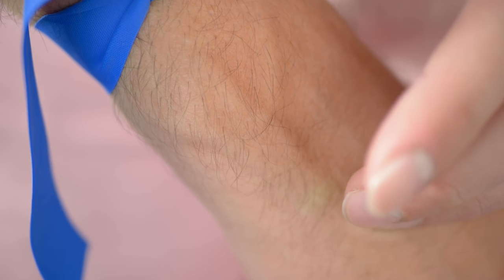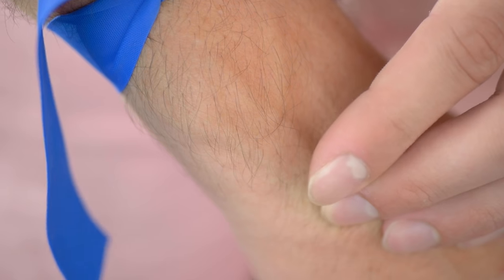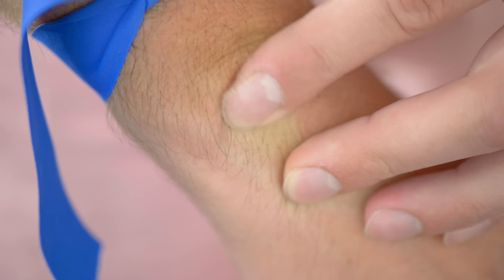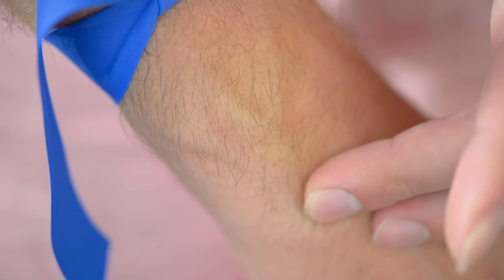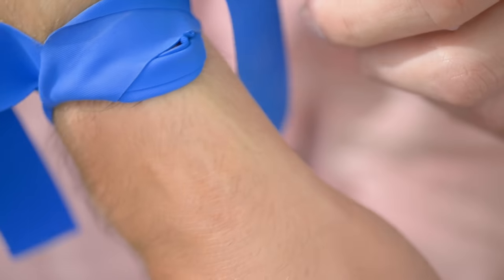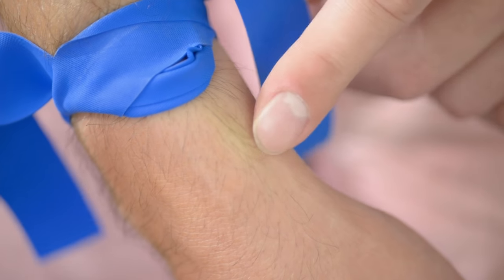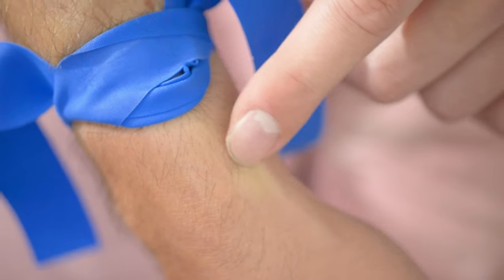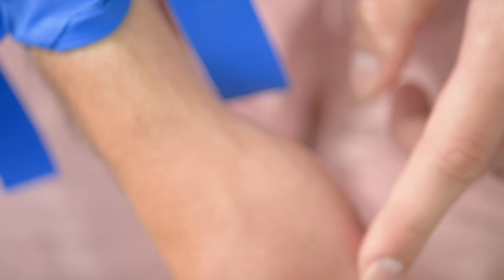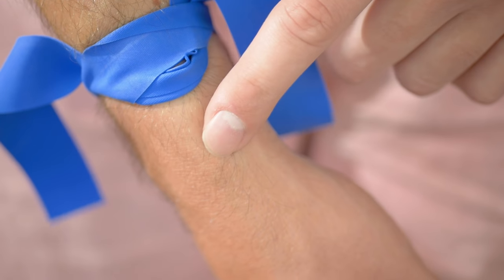This is an example of an area I would avoid — the bottom part of the Y — because if you hit the center point where all the veins join, you might have real difficulty getting the catheter all the way in. Instead, try to pick one of the top ends of the Y and start there, so you know you're not going to run into something problematic. Moving along, that radial vein is a good option, particularly in women — it tends to pop up a little better than normal.